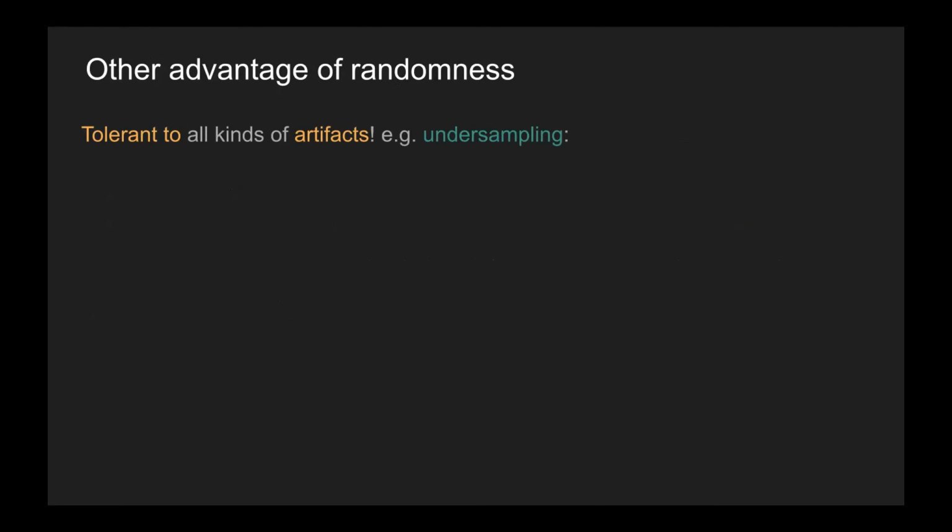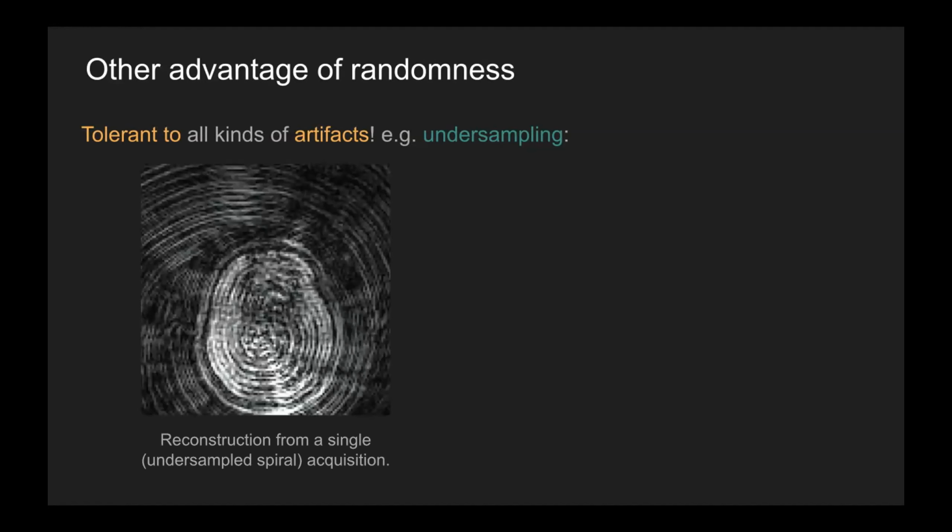If we think about the artifacts that we've seen in this class, we know that artifacts are a result of the different sequence parameters. But I just said that the sequences are random relative to each other, which means that their artifacts have to be uncorrelated relative to each other. And so the only underlying signal remaining between the different sequences is the actual signal that we wanted to measure. So more specifically, if we look at a single acquisition from MRF, it's extremely undersampled.